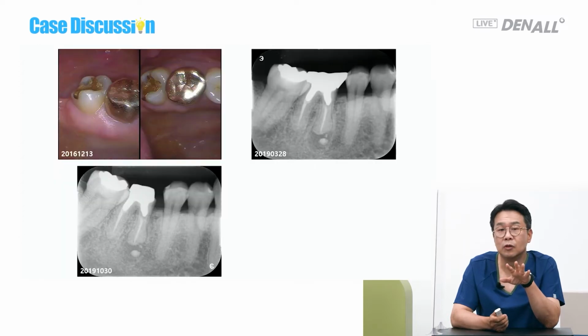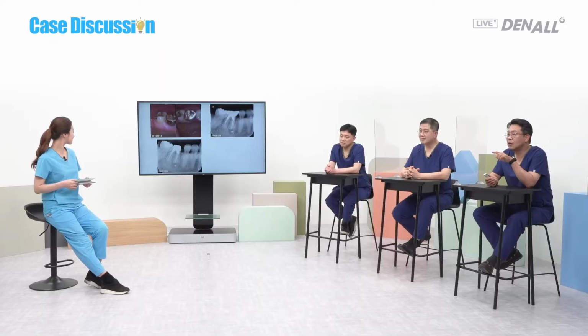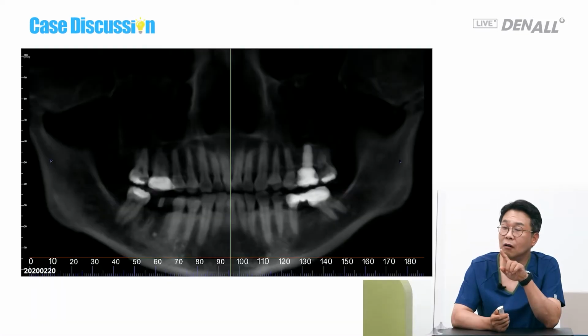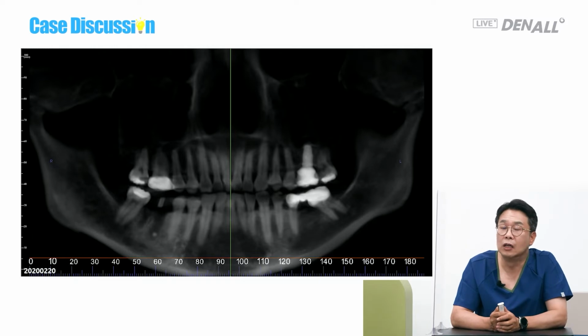It's healed. On October 30th, 2019, it was extracted, and after 4 months, in February 2020, the extraction socket remains as it is. I try to do something. When I suspect something like that, I try to do curettage thoroughly to expose fresh bone. However, it didn't go well.